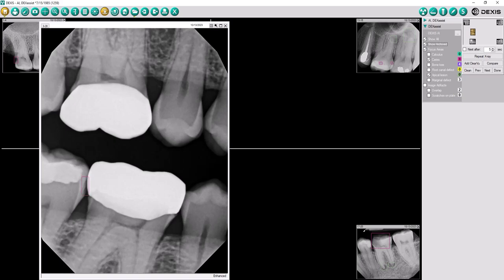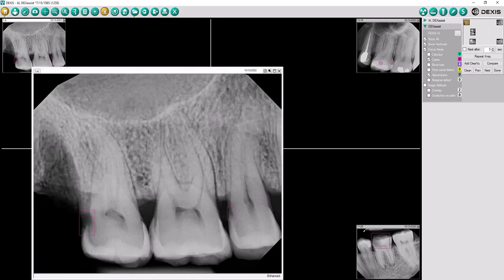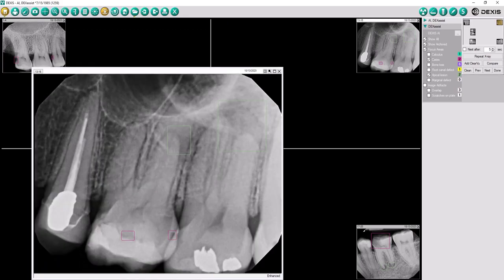DexAssist solution allows you to quickly identify focus areas when reviewing intraoral x-rays. The AI features allow you to share these findings with patients in an easy-to-see format when presenting your treatment plan.